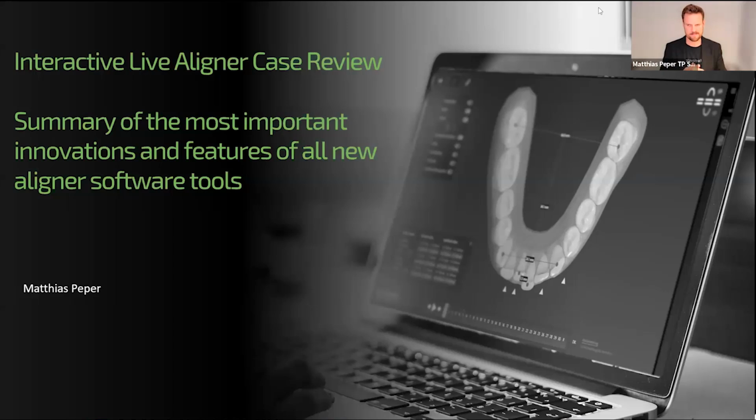And we will also give you today an idea what are our favorite tools and how we personally use them.